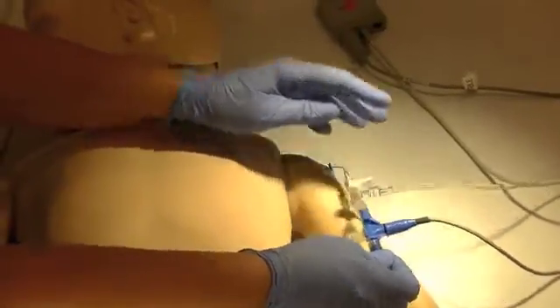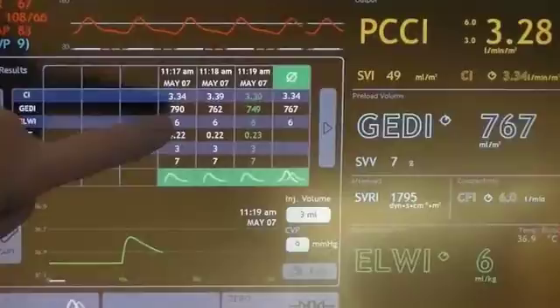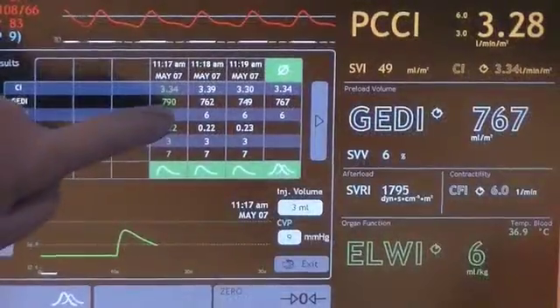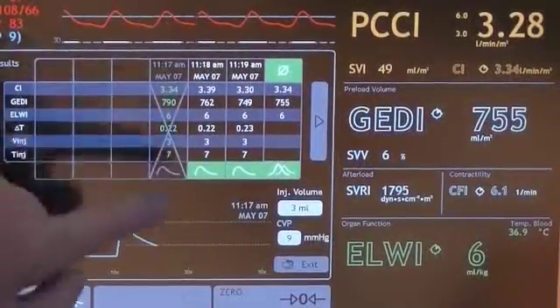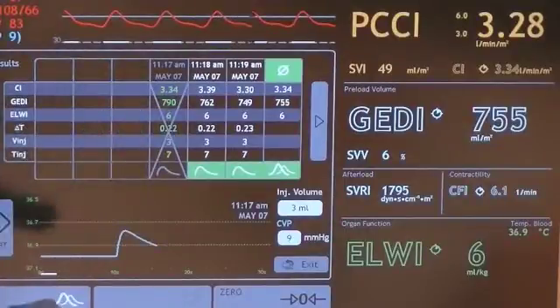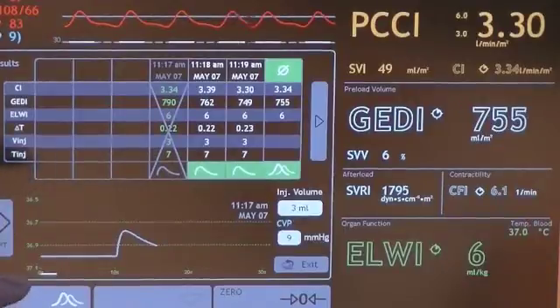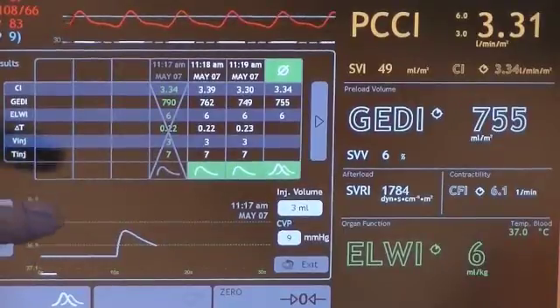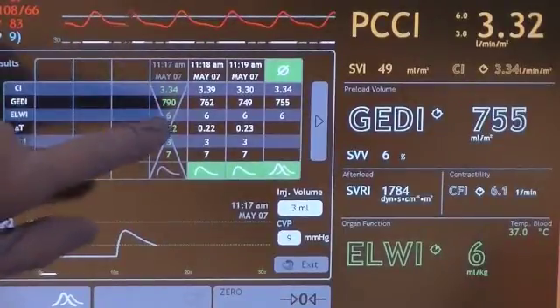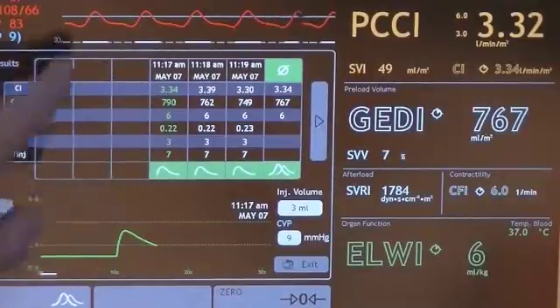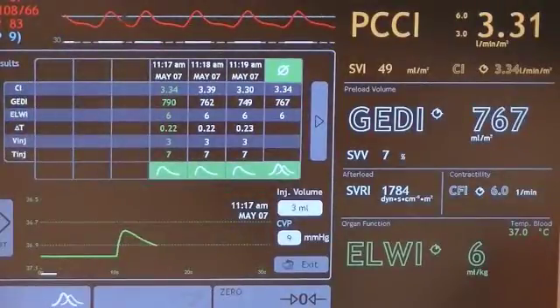If you wish to cancel a specific calculation, press that specific column once to highlight it, then again to remove it from the calculation. An X mark will be displayed over that column. However, if you wish to include the cancelled column, press that same column for the third time. The mean is calculated from valid measurements and is automatically saved.